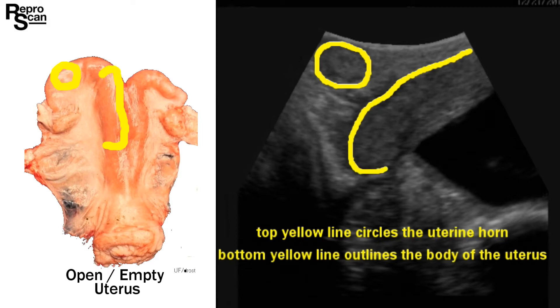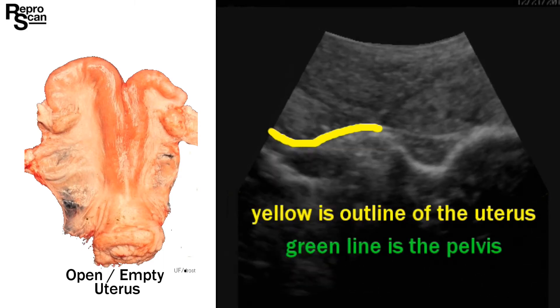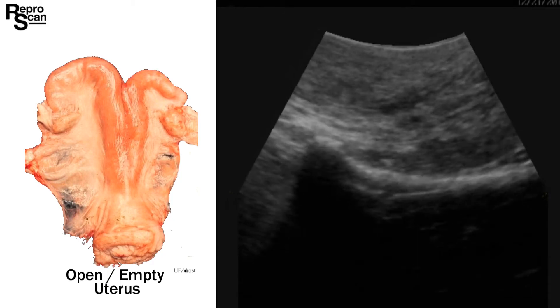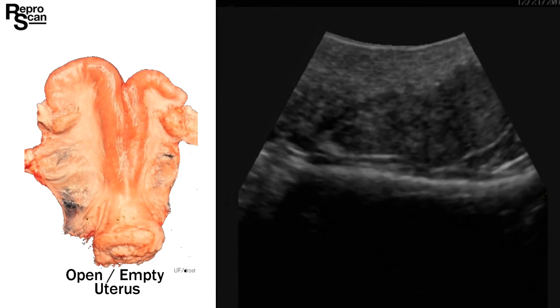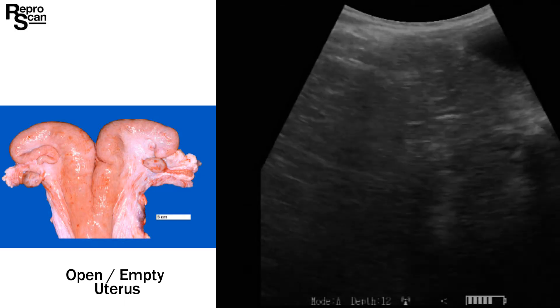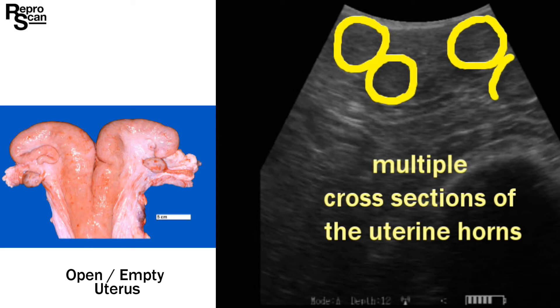There's a cross section at the top, and now we've got a slice through the body of the uterus. We're rotating that probe over the uterus and outlining it again in yellow, highlighting the pelvis. Note that it's mostly black under the pelvis — ultrasound doesn't go through the bone, though we get some artifact. Focus on that different gray color, looking for cross sections of that uterus. On to exam four: we have a cross section of the uterus. We want at least three cross sections before making a diagnosis of open or empty.